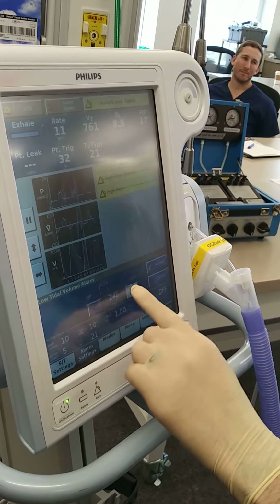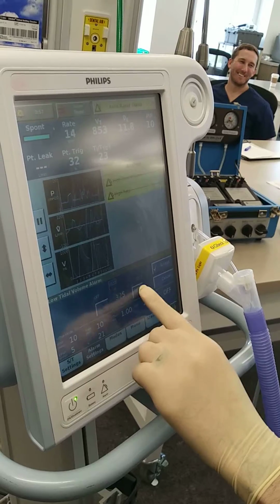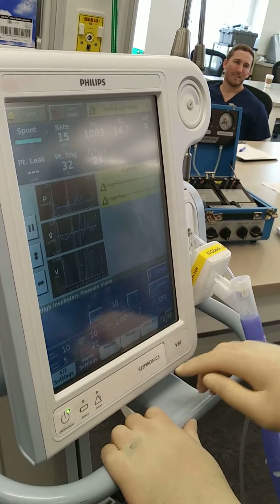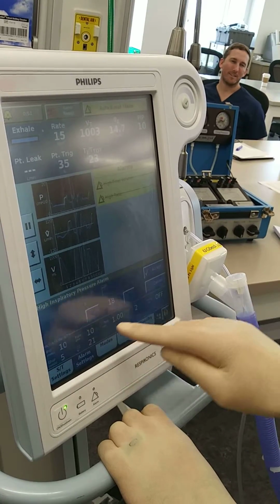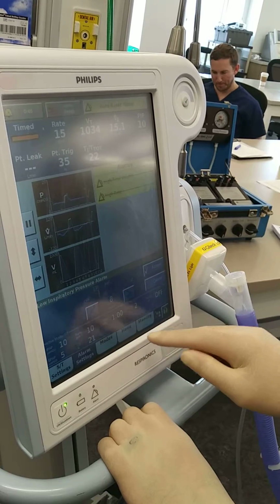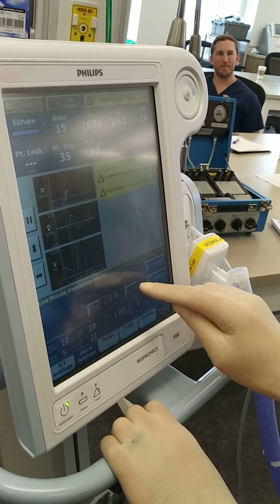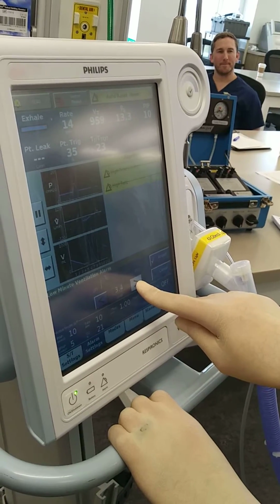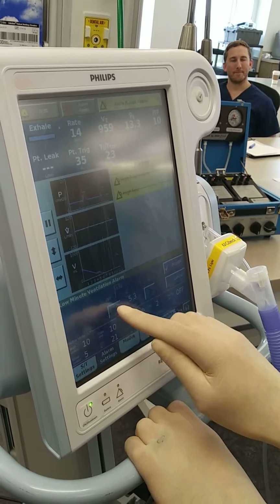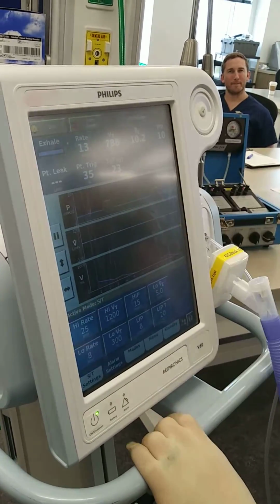So the low tidal volume, I'm going to set 300 or so. High pressure, currently our pressure is 10, so maybe 15. I like round numbers. Low minute ventilation, current ventilation is 15 liters a minute, so 1 point something is a little on the low side. I'm going to go up to maybe 5. And then reset, and that should be okay.